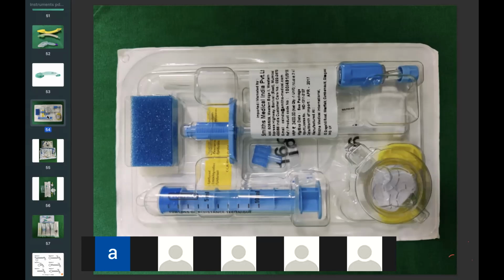or epidural first. So, ma'am, we'll give epidural first. We'll secure the epidural catheter, and at the lower level, we'll give the spinal block. Correct. If your epidural catheter is going up, you will give the spinal at the lower level, right? Yes, to avoid injury. Yes, correct.